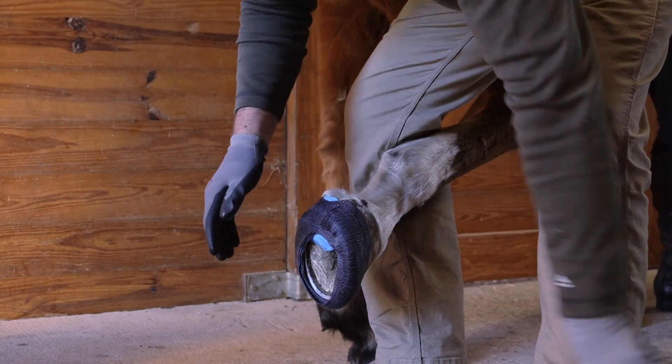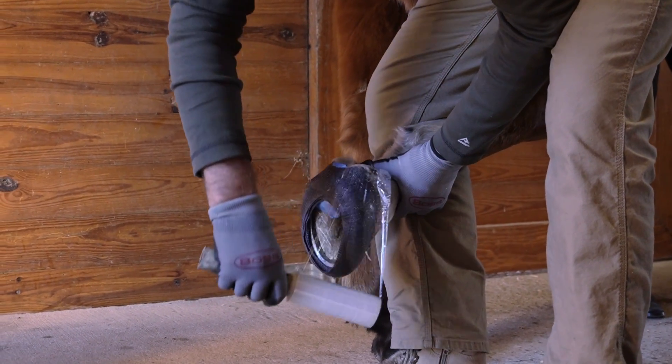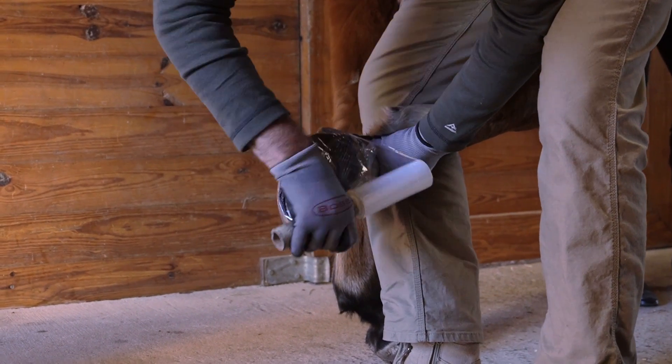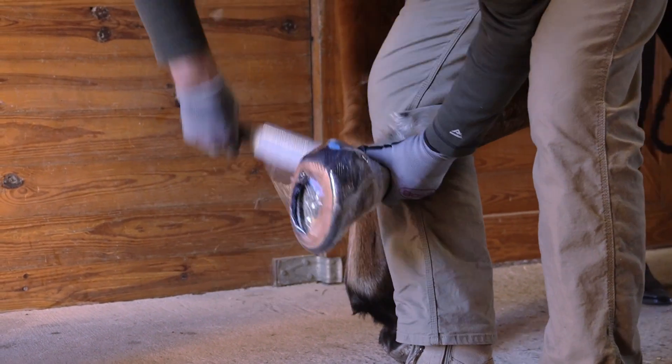Once you have unrolled the cast completely, use plastic wrap to help lock in the water for a better cure and help smooth the cast for a better finish. Start with at least one or two wraps over the heel bulbs before going around the rest of the foot.